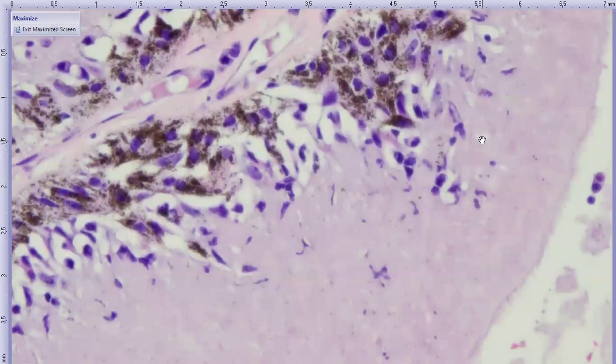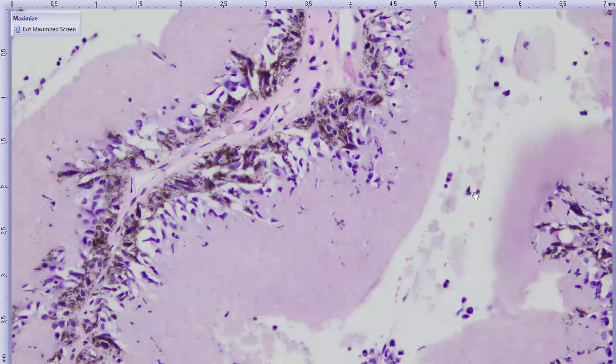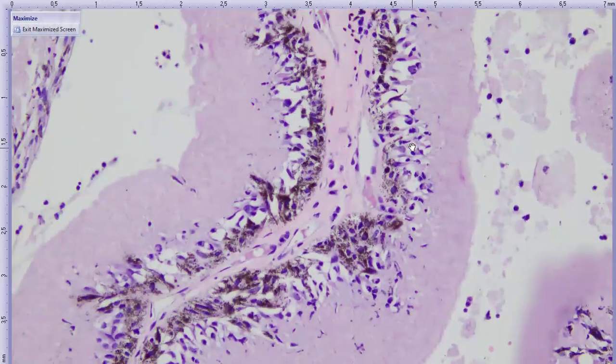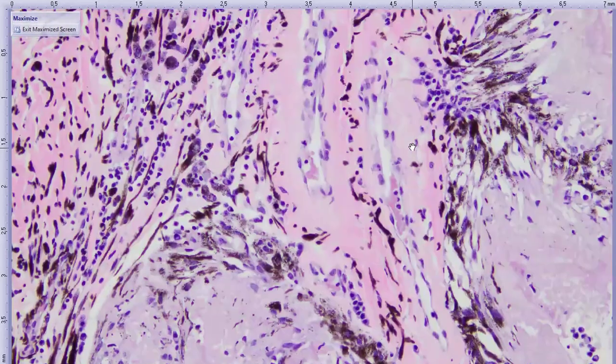So we have an amyloid carpet, especially over the ciliary body surface. We have linear eosinophilic inclusions in the non-pigmented ciliary body epithelium. And then the last thing that can be part of this diagnosis: we can see lymphocytes and plasma cells admixed with the epithelium here. And if we go into the stroma of the anterior uvea as well, we have some lymphocytes and plasma cells infiltrating the anterior uveal stroma. And so we have a lymphoplasmacytic anterior uveitis.